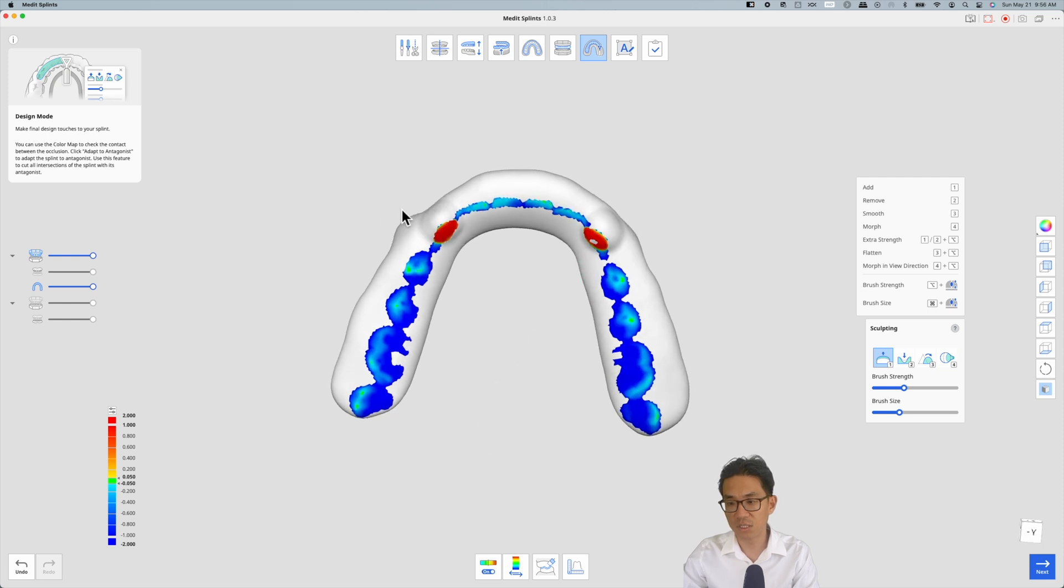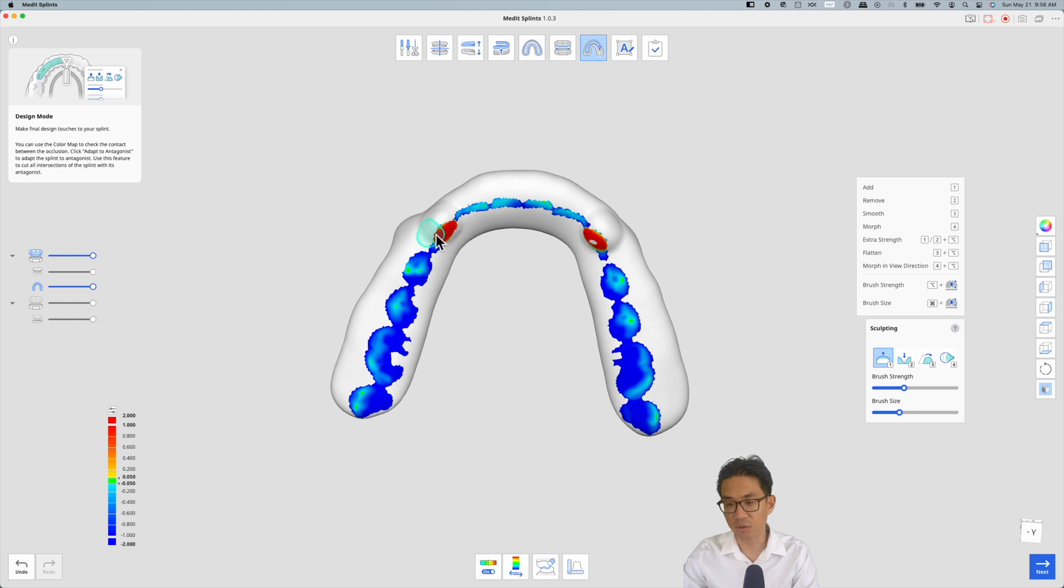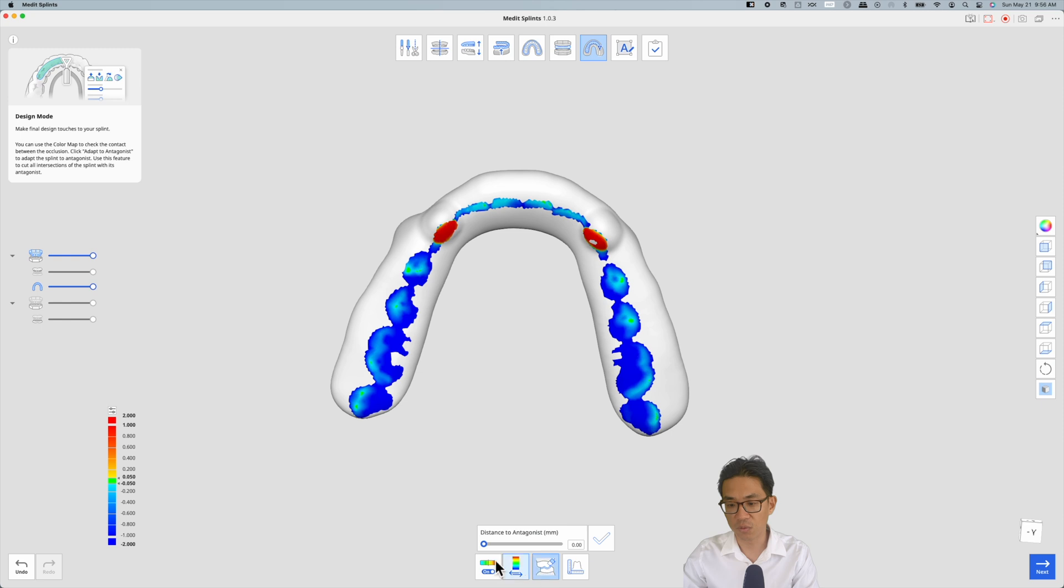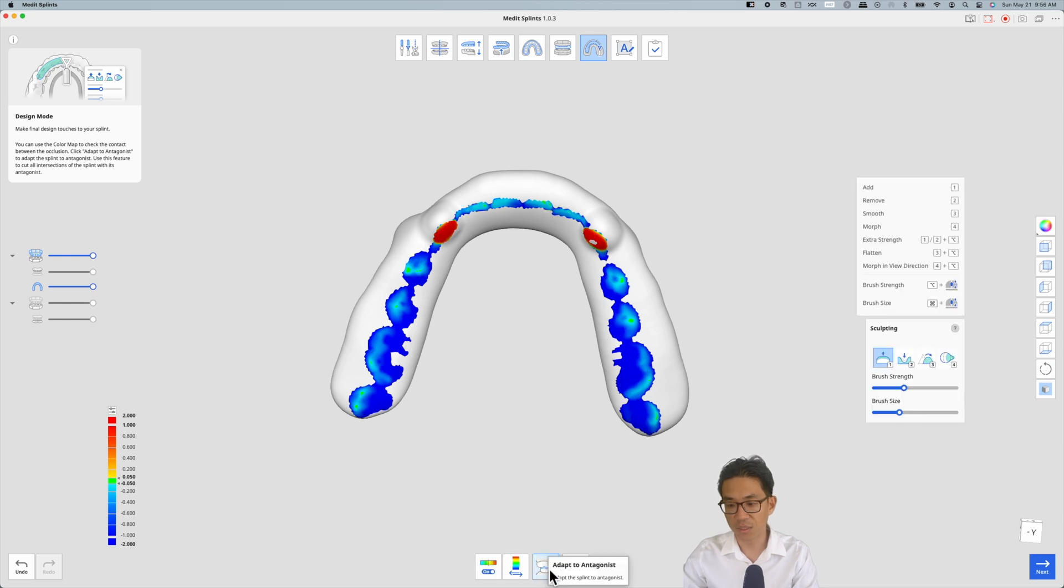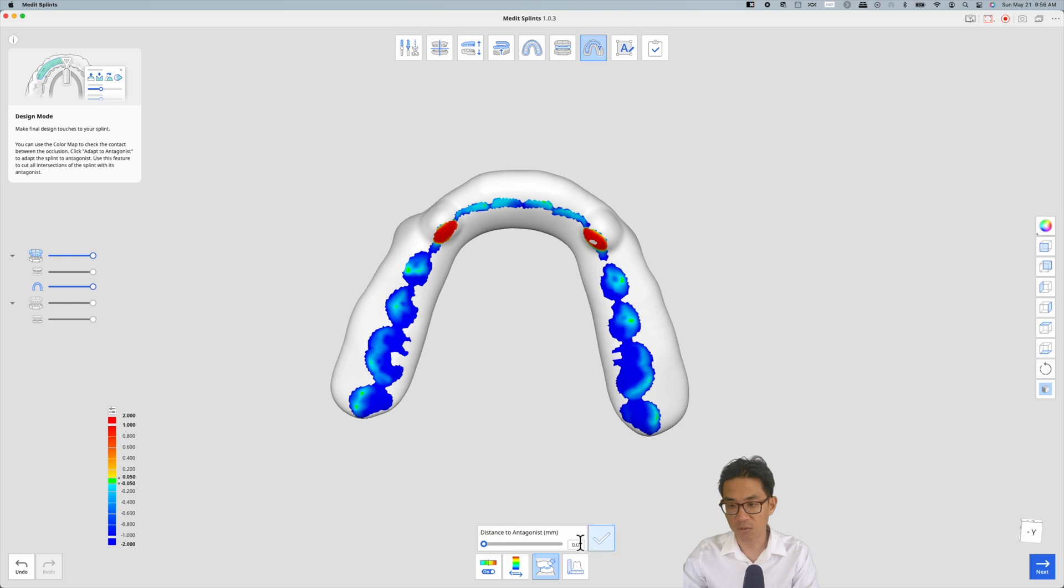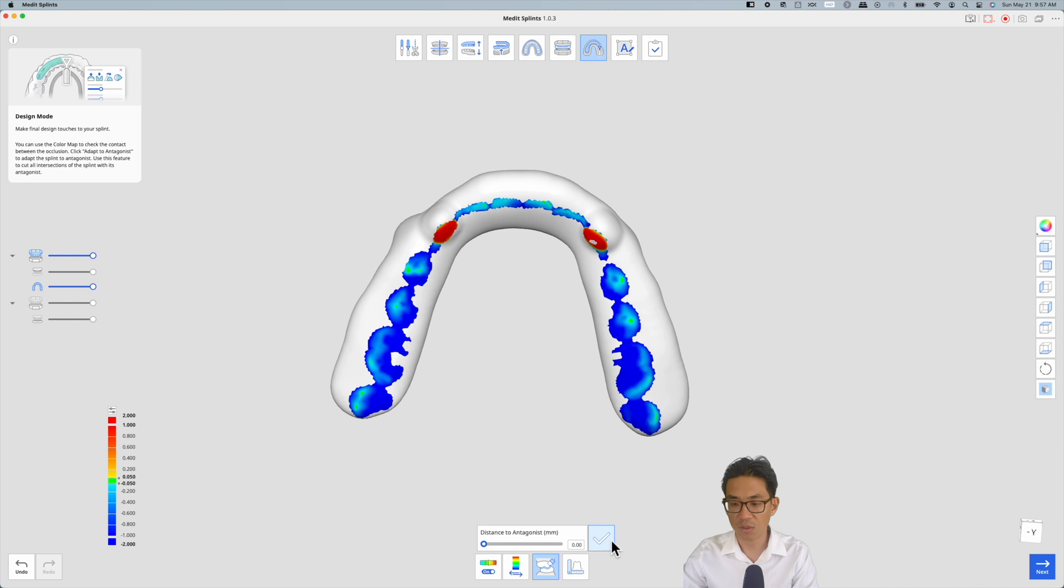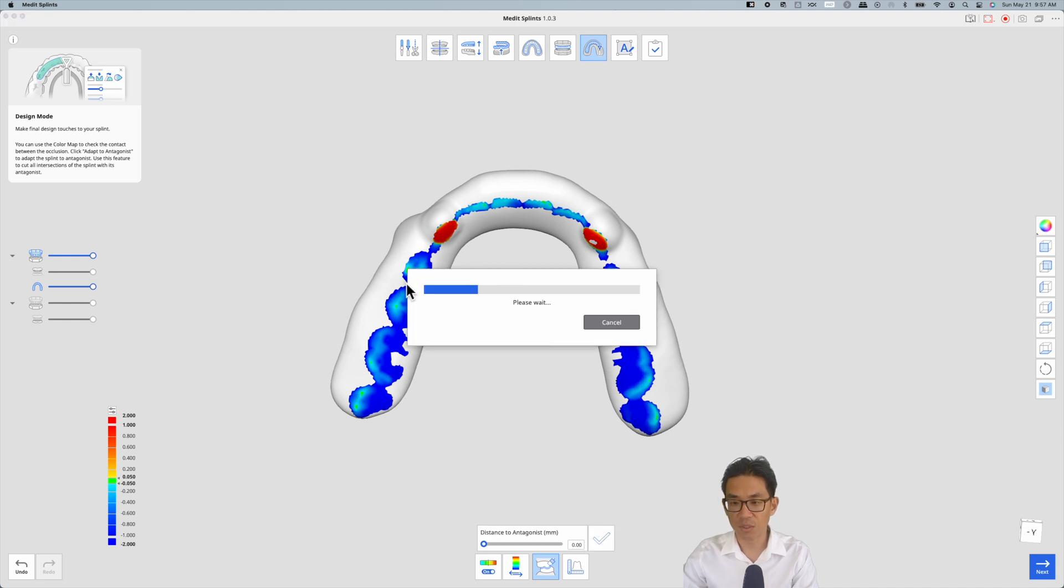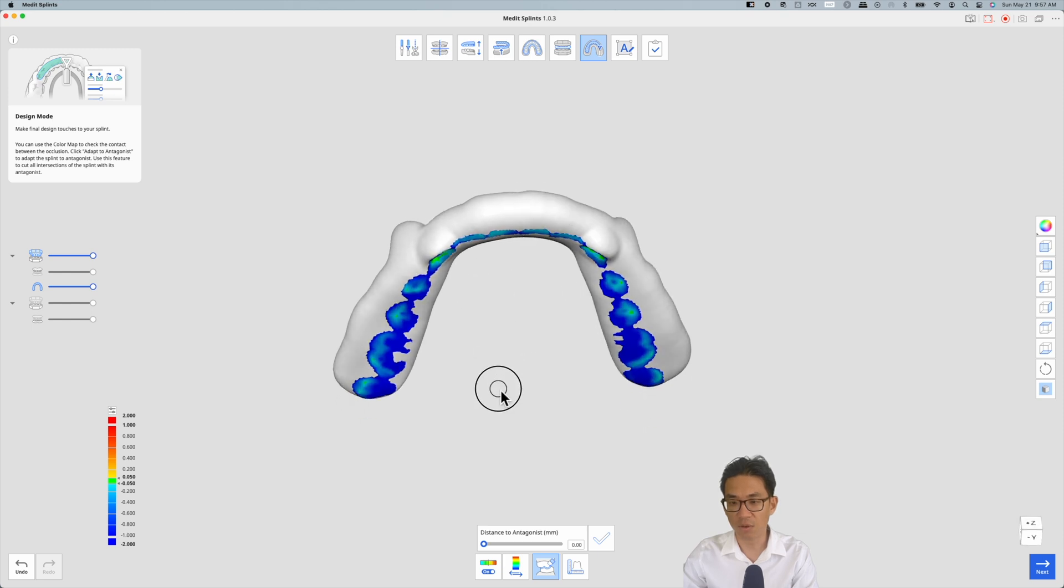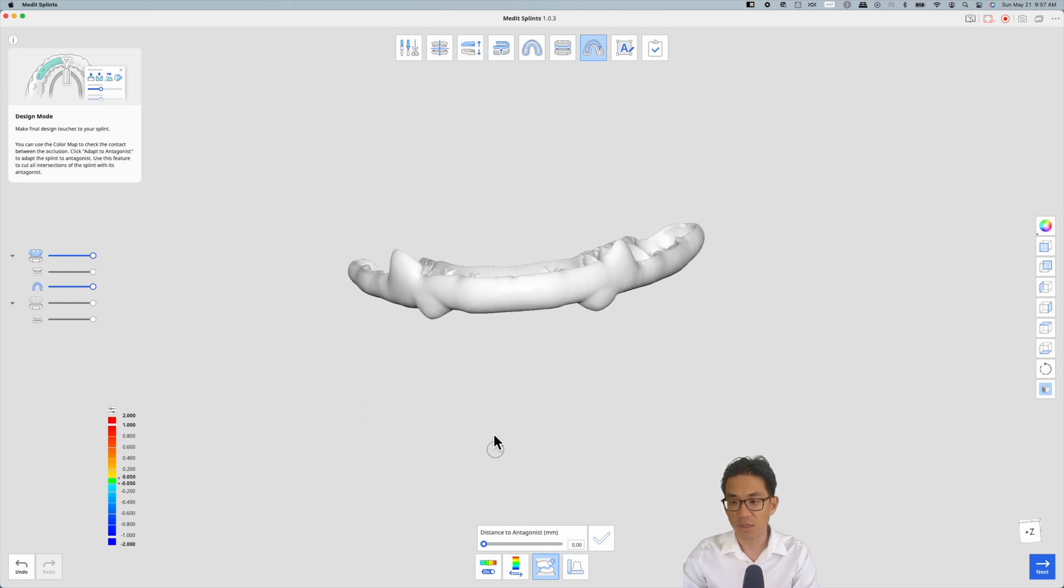You can see the bumps that I added add quite the interference where the lower canines are. To simply get rid of that, I go to this adapt to antagonist option, set it to zero so that the antagonist has zero distance between the lower canines and these canine rise bumps here. I just hit checkmark and what that will do is then relieve those areas and now I have a night guard that has canine rise.